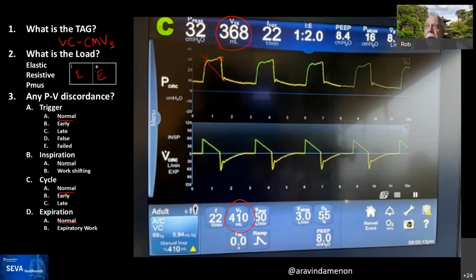Even if you just had an HME, so maybe if you had a patient on without anything, possibly, but I doubt it. I don't think that's it. What if it is a proximal flow sensor? I don't believe you can have a proximal flow sensor on this vent. But I'm not sure what the vent is. I think it's a 980. It is a 980, yes. And I think if there's a flow sensor, it's only for neonates, if they have one. I'm not sure. So thank you.